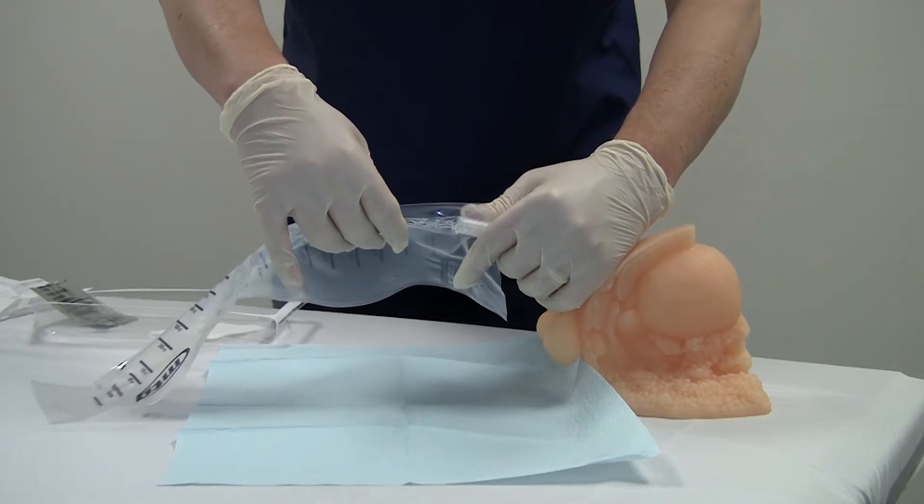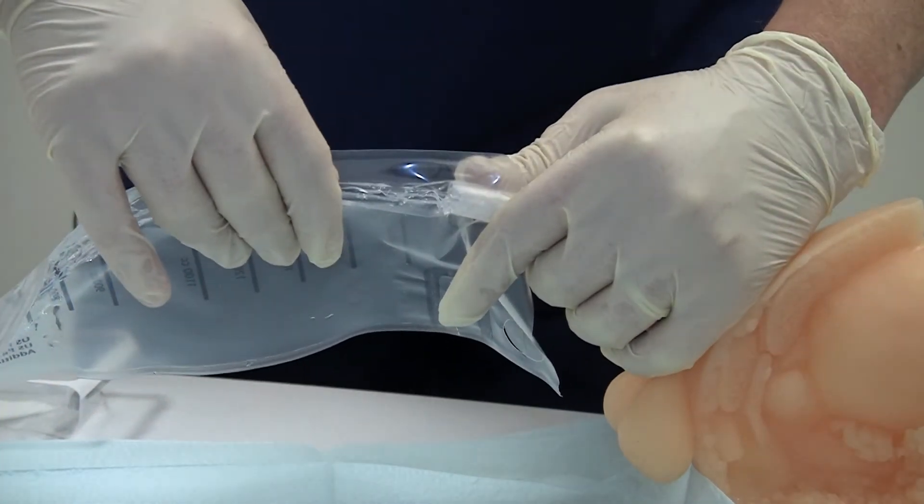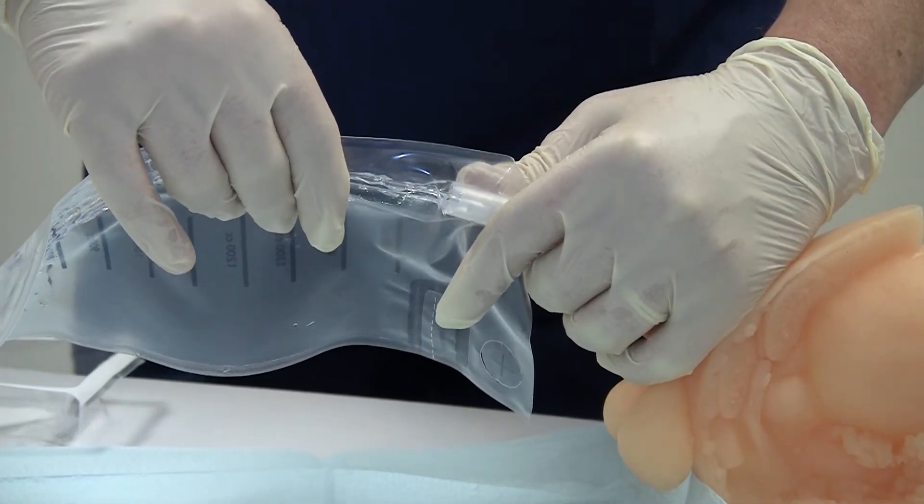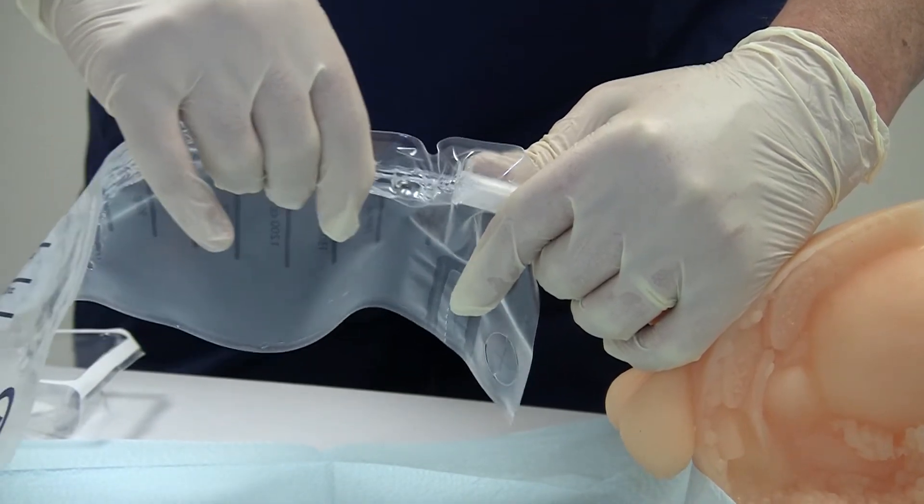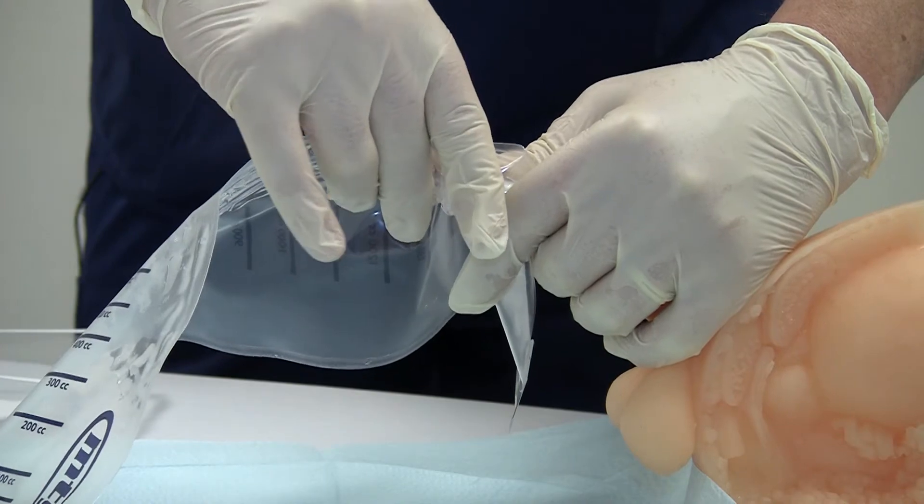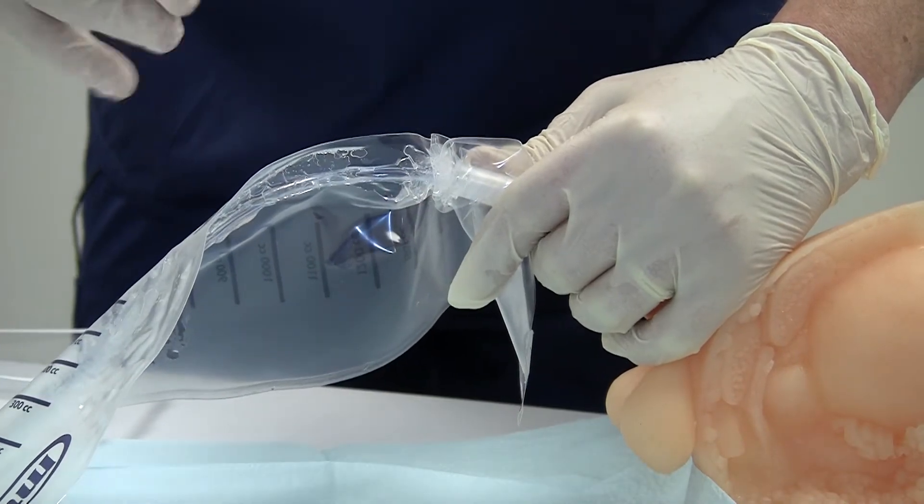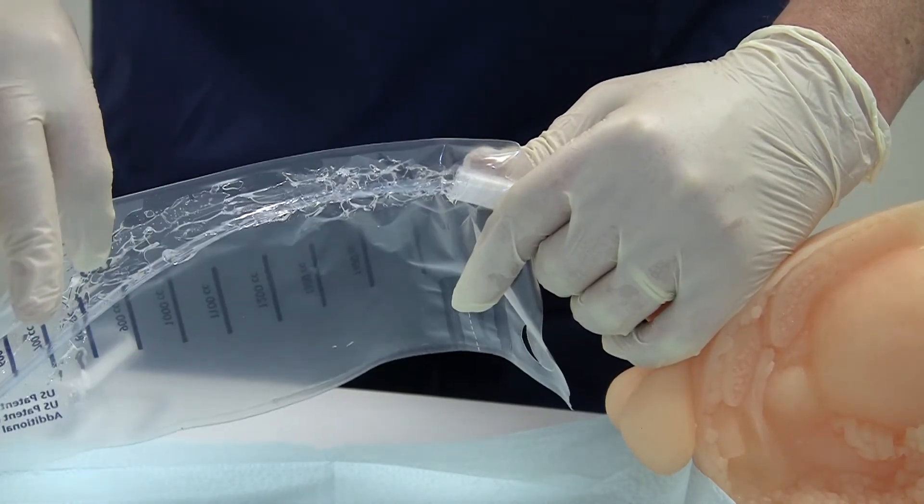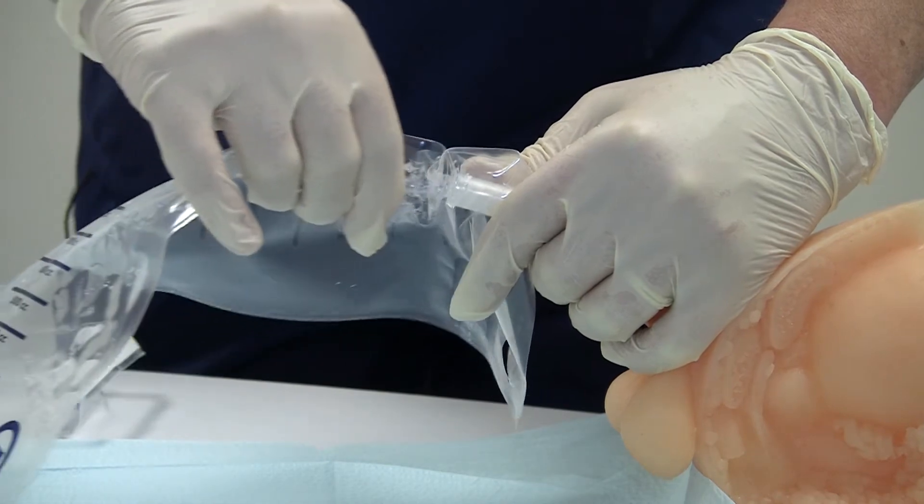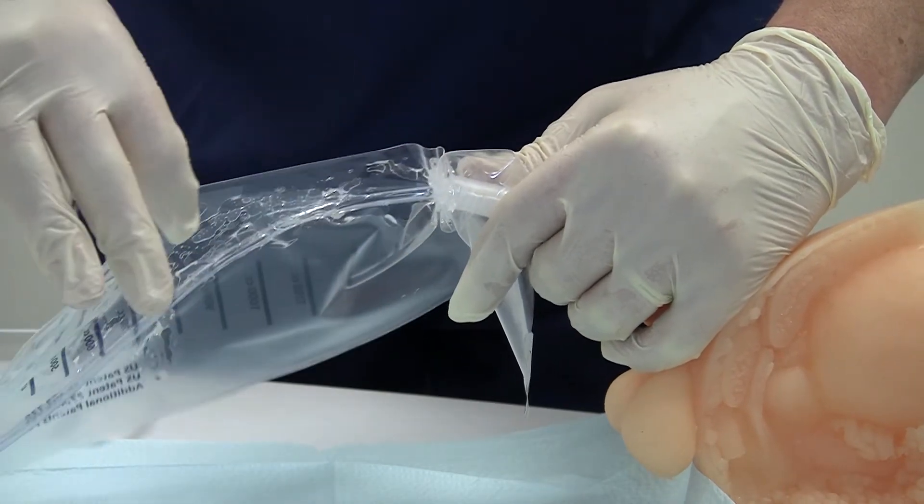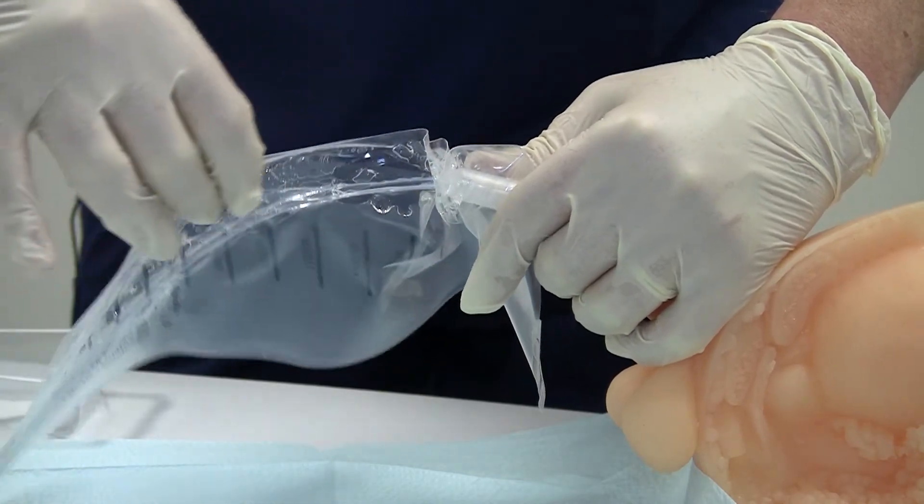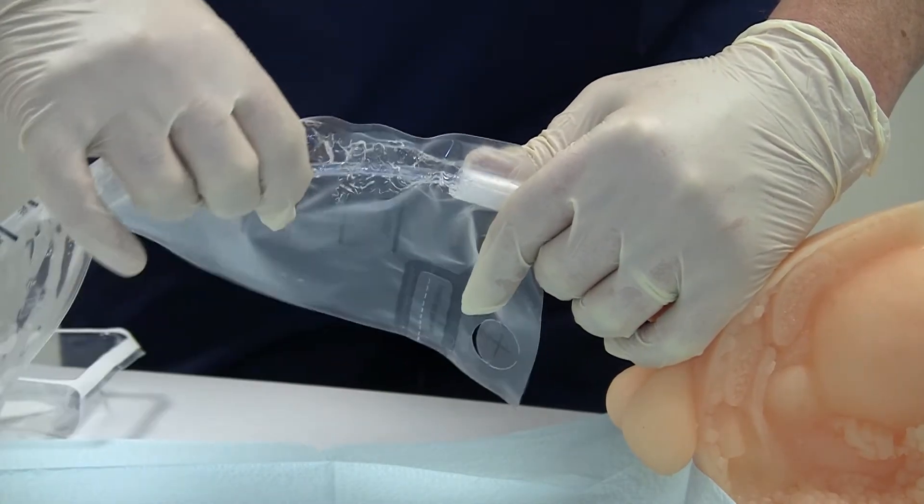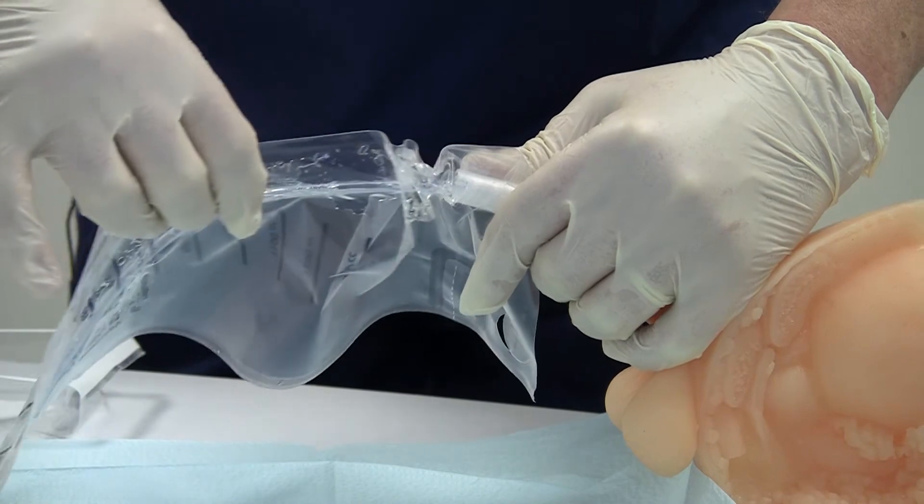All I have to do now is go back to the catheter. The bag is graduated. At the 1400cc mark, it's about a good place to start. I'm going to advance the catheter at one to one and a half inch intervals. Advance in. I'm not squeezing anything because of that locking mechanism I described earlier. Notice how easy the bag is to push back. Insert in. Straighten the bag. Insert in. Straighten the bag.